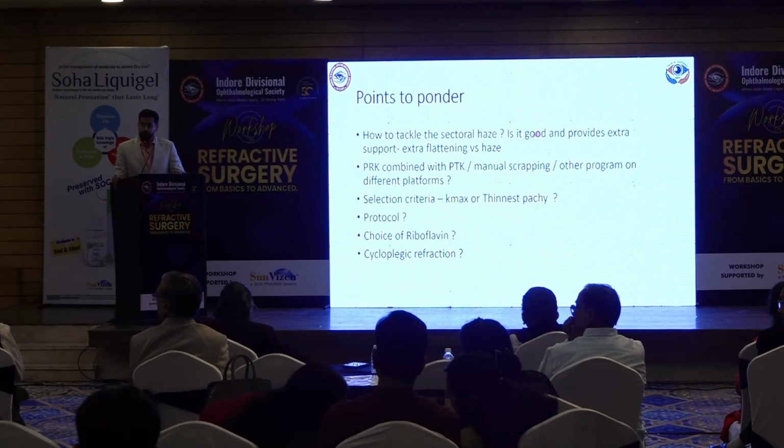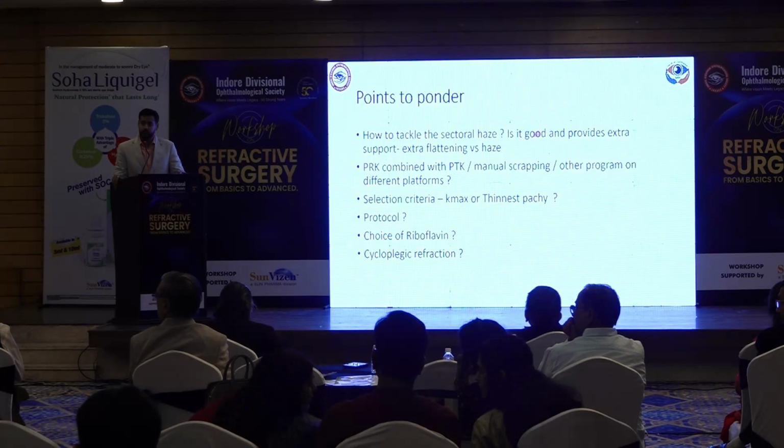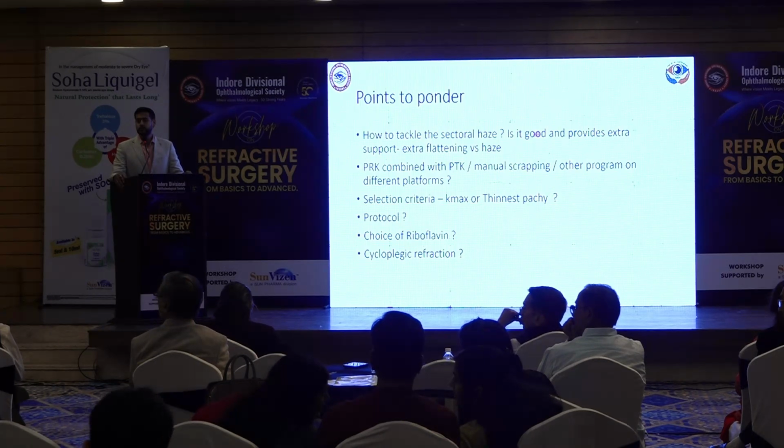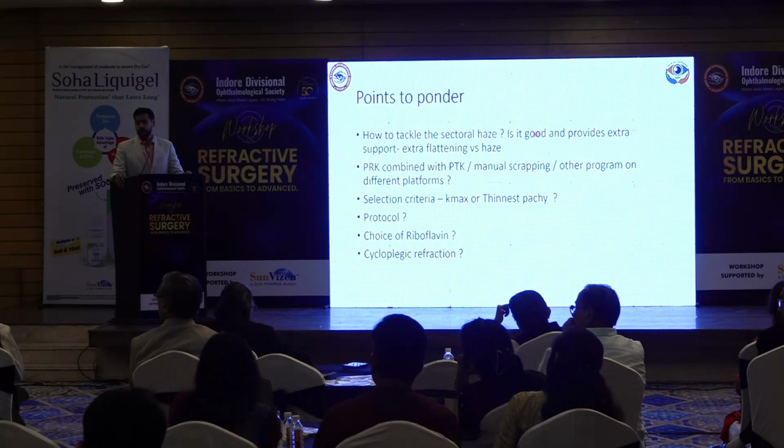Manual scraping induces changes in your keratocytes. There could be more chances of haze. Try not to use alcohol at all in this, because keratoconic keratocytes are very metabolically active. Alcohol will trigger more challenges for you and cause more haze.